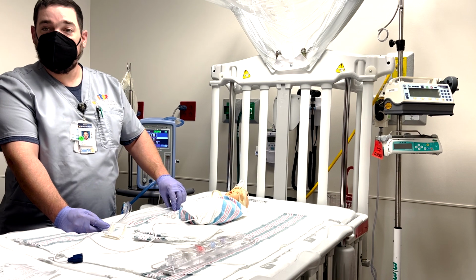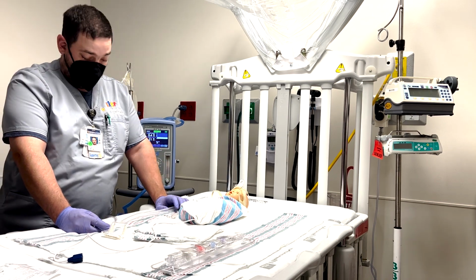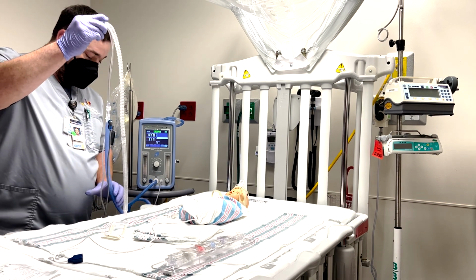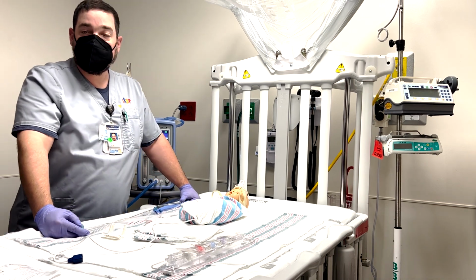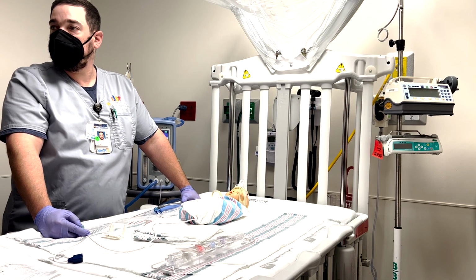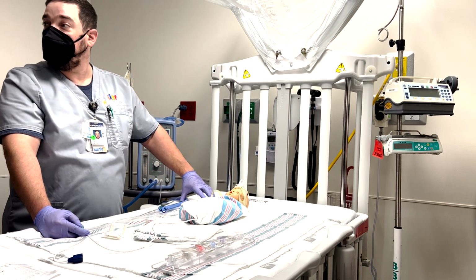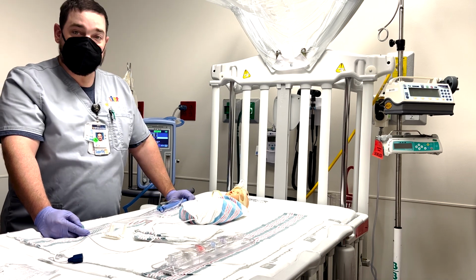How about the 2 or 3-year-olds? Same thing. Like the nasal CPAP, like Jen said, up to 42 centimeters head circumference. So if we can't do it, then we've got to talk about different strategies. At what point are you going to need sedation with this as well? Like, what if the child's agitated? You know what I mean? That is beyond the scope of this talk, but I'm sure we'll have another talk about it in the very near future. A good question.